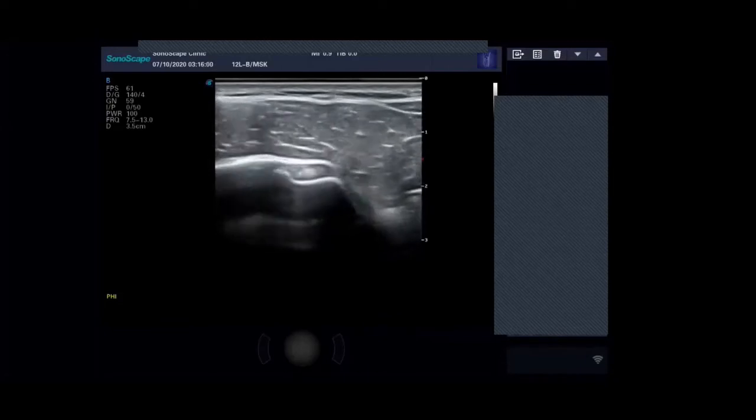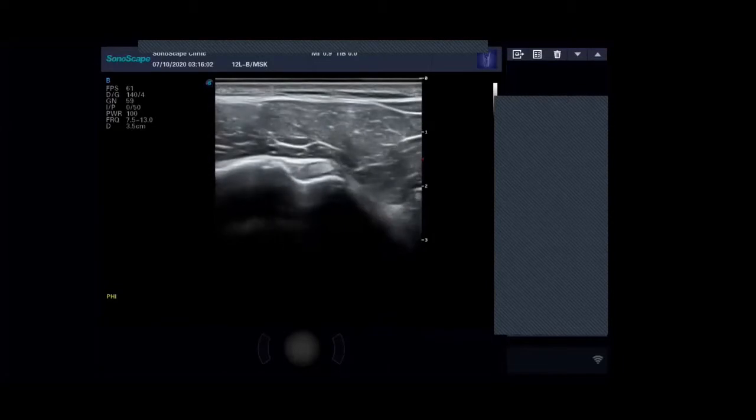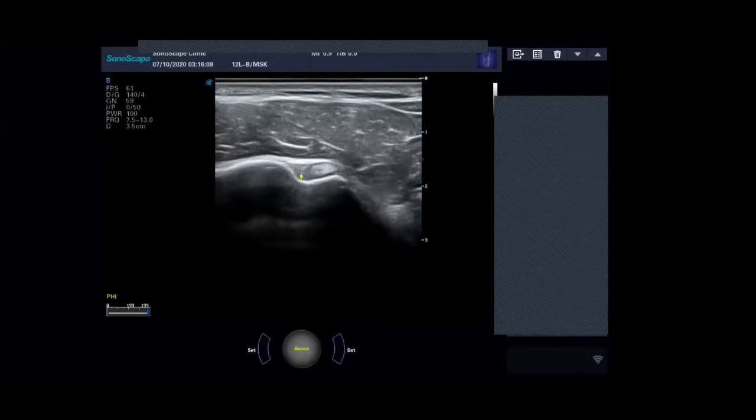So if there's any tenosynovitis here, you tend to get a little bit of fluid or a halo around the biceps tendon. I've got some images to show you of that a bit later, which we'll go through, but it'll be around here. You do normally have a little bit of fluid around that, and that can be classed as normal. If it's too much of a big halo around here, then that's probably pathological.